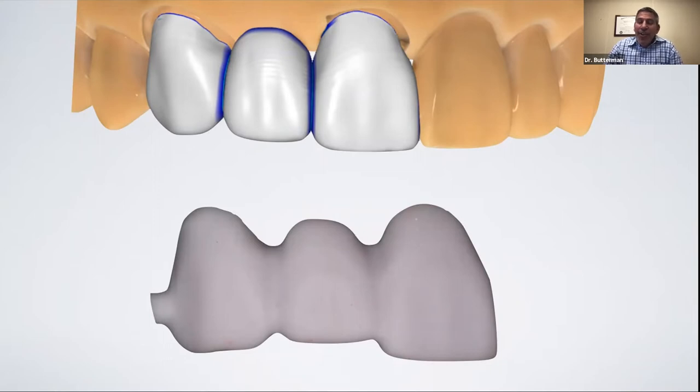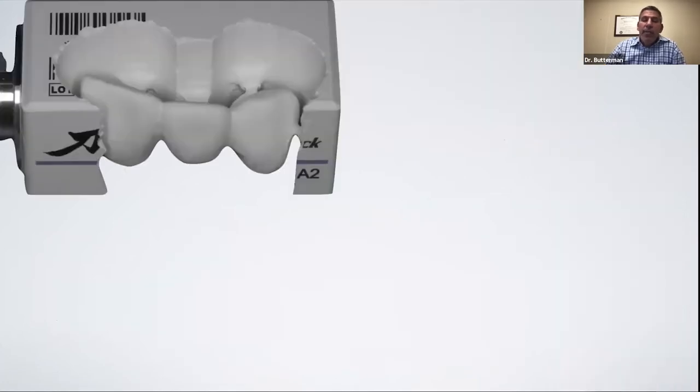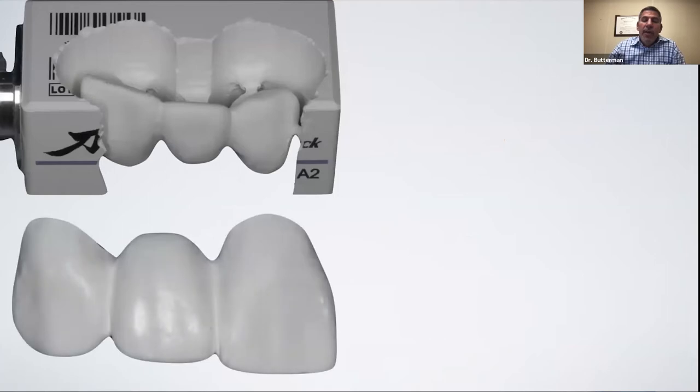So I love using zirconia for bridges in the anterior because the way they're going to come out is much different. So if we took this exact same case and instead designed this and milled this out of a Katana block, here's how it comes out right out of the mill. In about 5 minutes, I can just do a very light polish, just a little bit of contouring on this restoration. I'm going to sinter it.